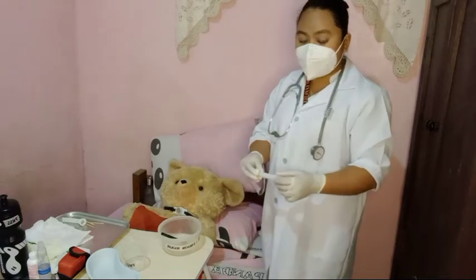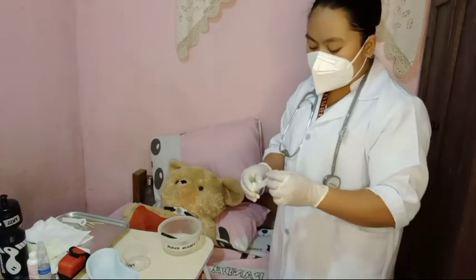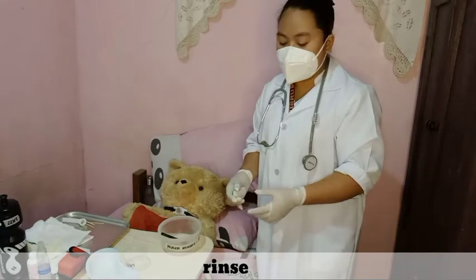And then check if there is still mucus left. Then rinse it in the second basin.